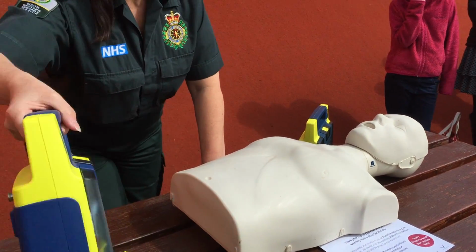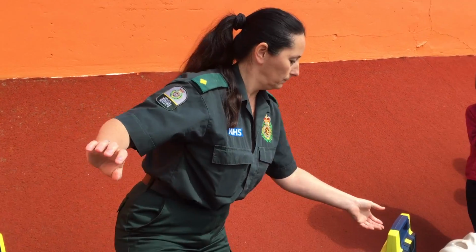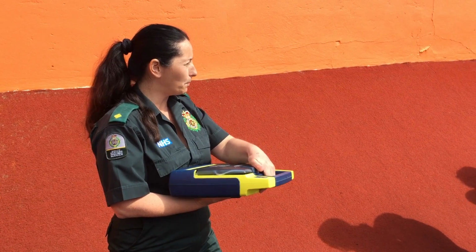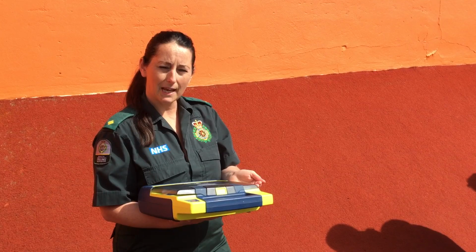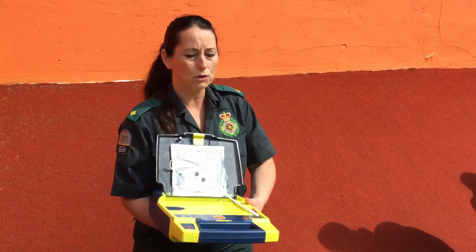Now your defibrillator, I don't want to use that one because that's the real one. Once you open this lid, it needs to stay open, because if it closes, it will have to go through the whole analysis of the patient again. So once it's open, you leave it open. We'll start talking to you and it will tell you what to do.